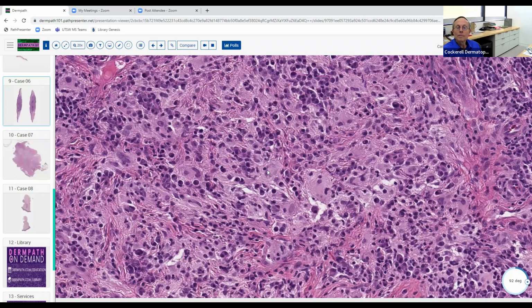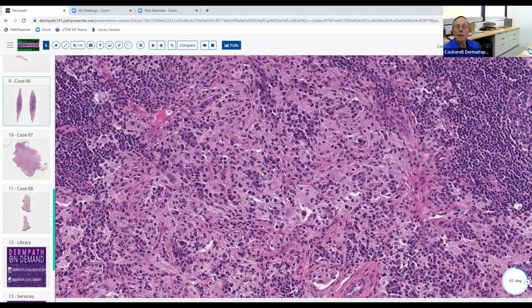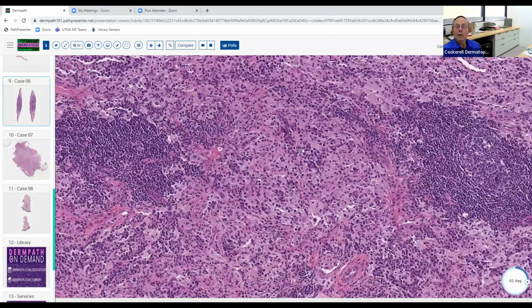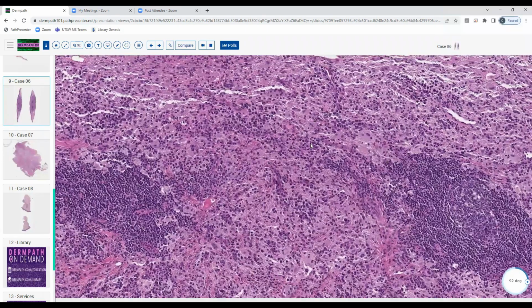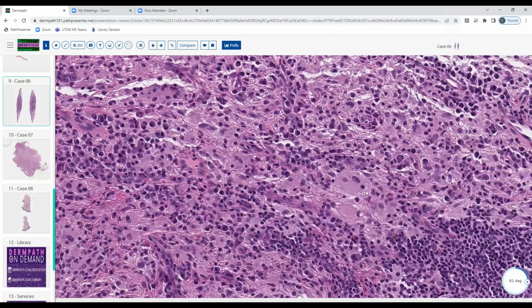Well, some of the histiocytes have lymphocytes and plasma cells in them. So that would be the emperipolesis phenomenon. Good. Superb. Excellent. So what's your diagnosis then? So we're looking at the histiocytic differential, but since they have emperipolesis, that's classic for Rosai-Dorfman disease. Good. Rosai-Dorfman disease.